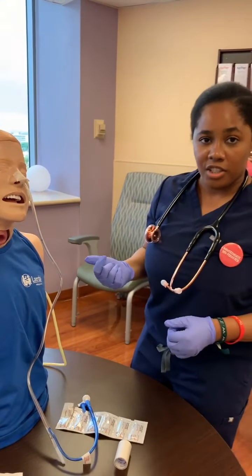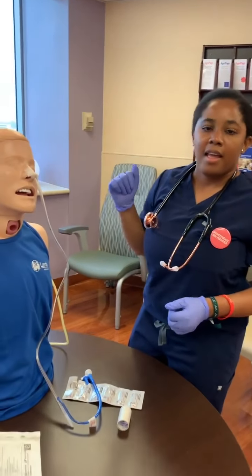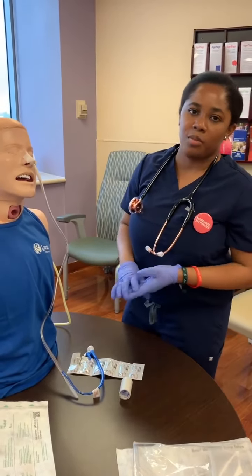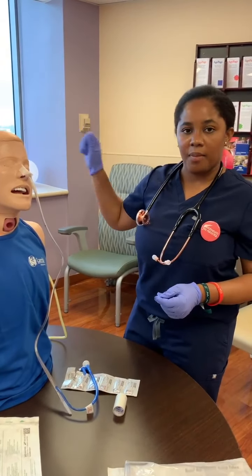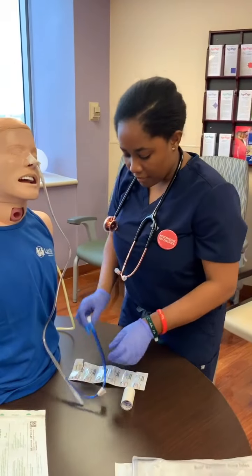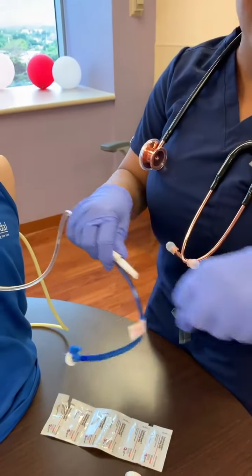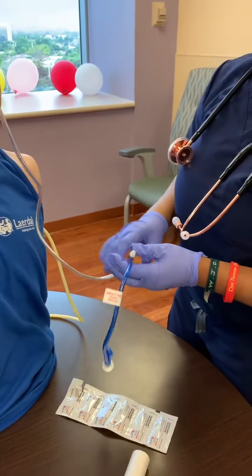Also, if it is ordered to suction, you want to make sure that your suction was already set up on the wall. Just know that whether the suction is supposed to be continuous or intermittent, you're going to set that up and then connect this to suction. This portion here is what you're going to be connecting to the actual suction catheter so it can go into the actual suction canister.